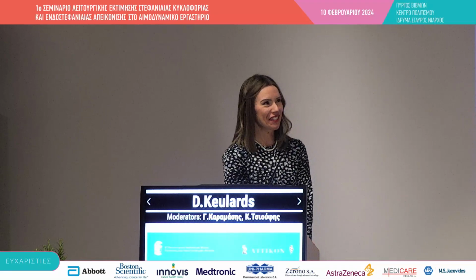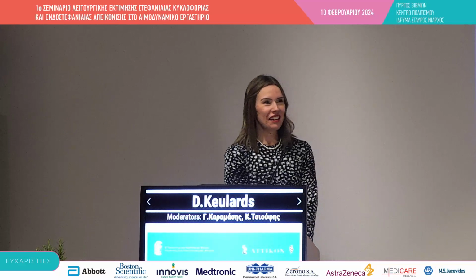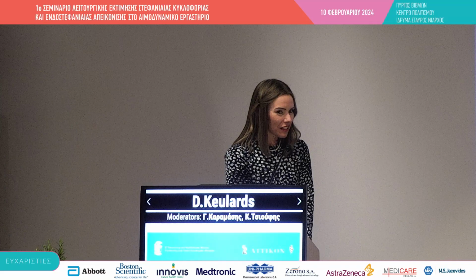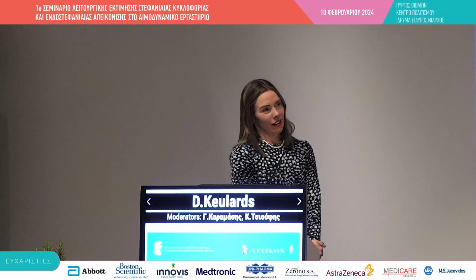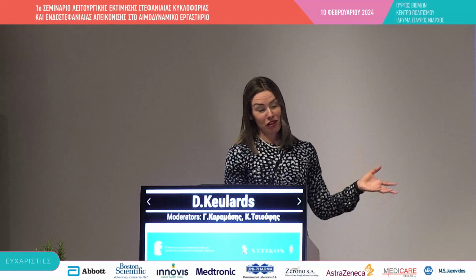Sorry, could you recap the question? Difficult question. Adenosine FFR is not actually the FFR that you can get when you're exercising. We did not investigate it. In this method, we do not use adenosine at all, but it is compared with adenosine.